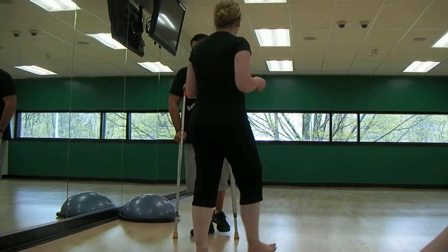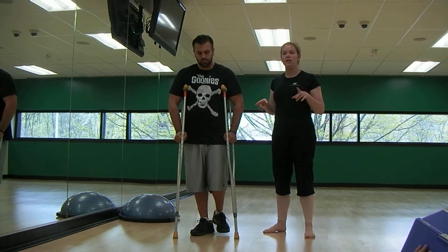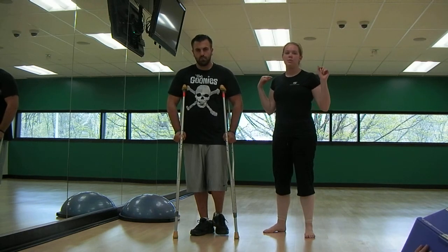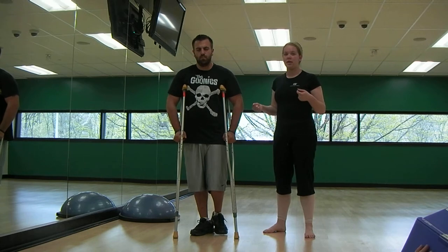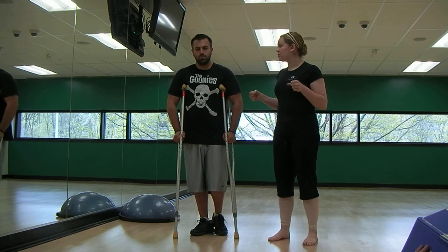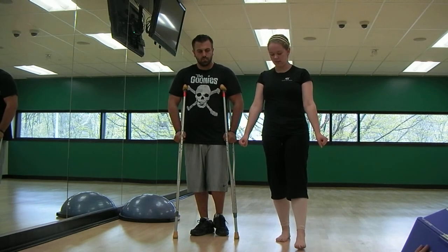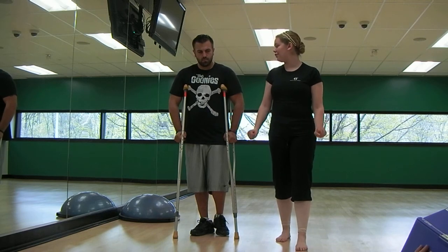Alright, so now Jordan has successfully reached 50% weight bearing, so we want him to get to at least 75% weight bearing on his affected side, still using the crutches. You're going to still walk through the same way that I taught you with the crutches going forward, your affected leg, but you're going to put less weight through the crutches.